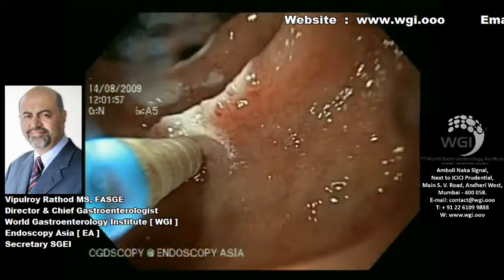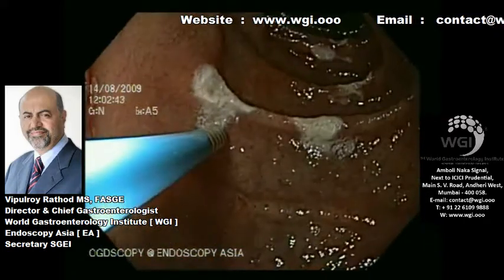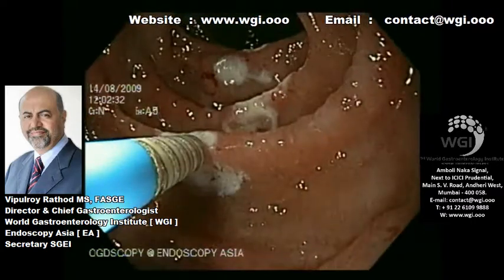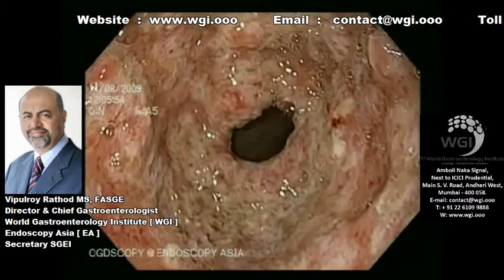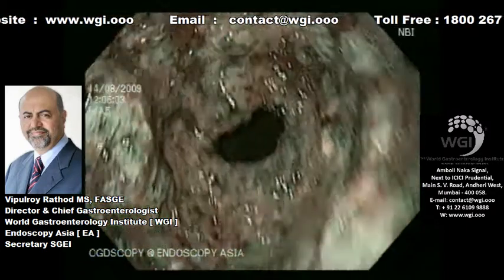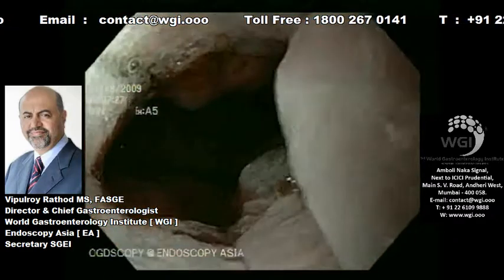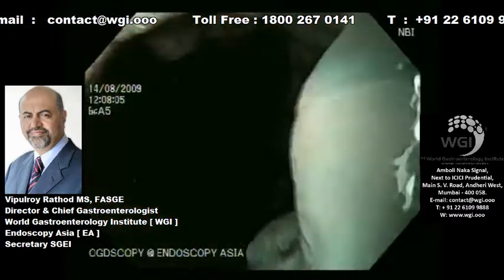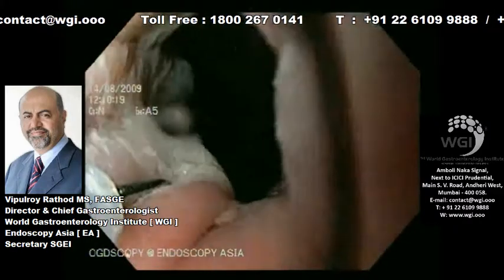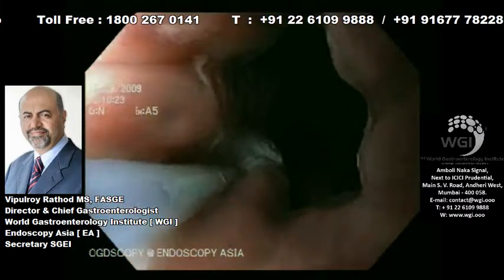Following this, we will treat the gastric varices with a combination of histoacryl glue 0.5 ml diluted with lipiodol 1.5 ml, and we tend to inject it after priming the needle directly into the gastric varices. As you can see from the picture, the gastric varices will form a white blob, which signifies successful therapy.